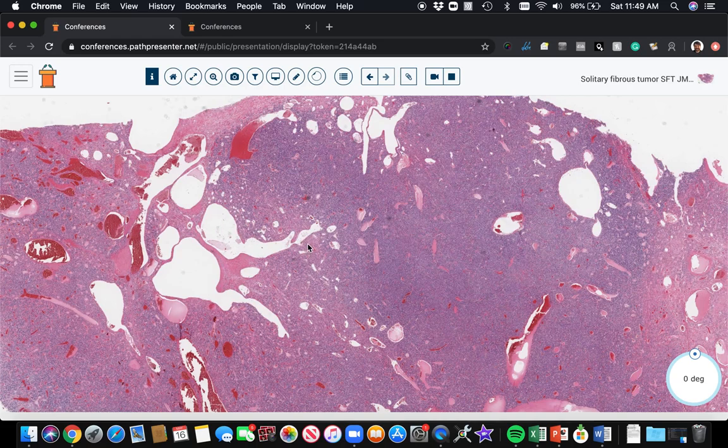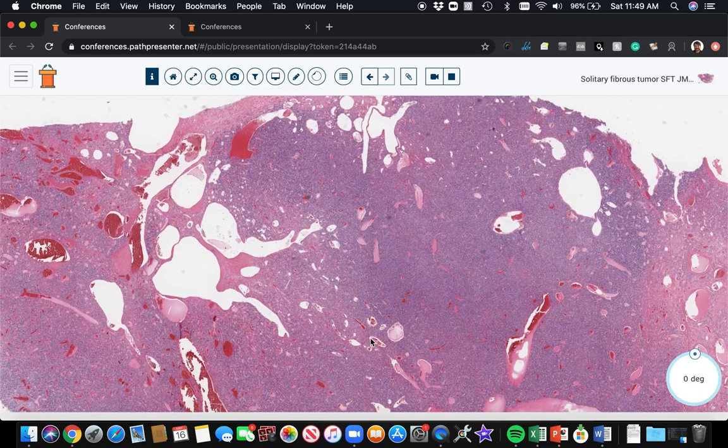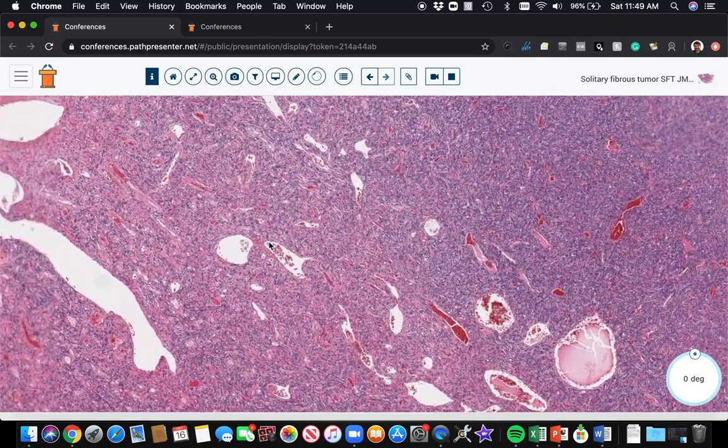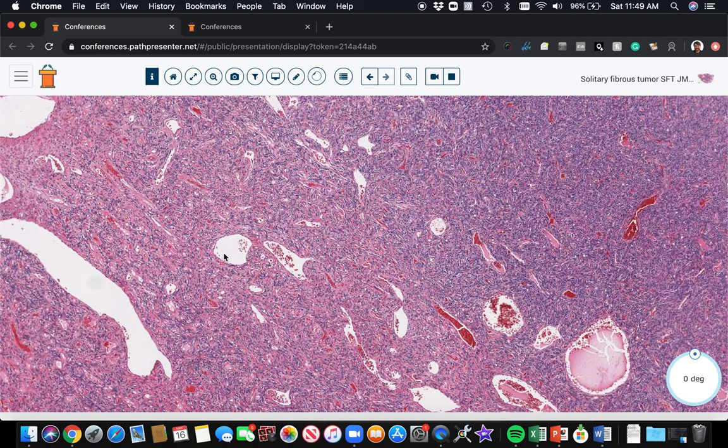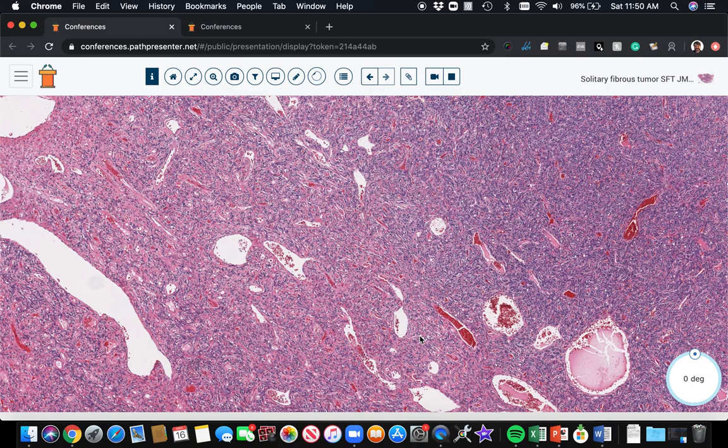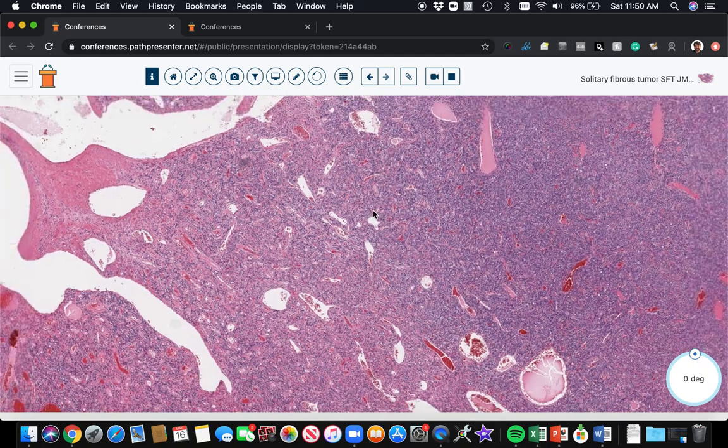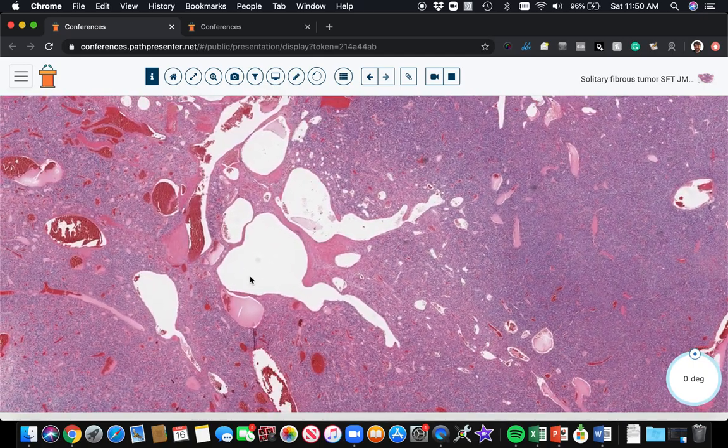Sometimes they're really big, branchy vessels like this. Other times, you just can have small vessels that kind of maybe branch once, or maybe they're just dilated and kind of round. So the range of vessels that you can see in a solitary fibrous tumor is pretty broad. It can go from these small dilated ectatic vessels all the way up to these huge ones like this.